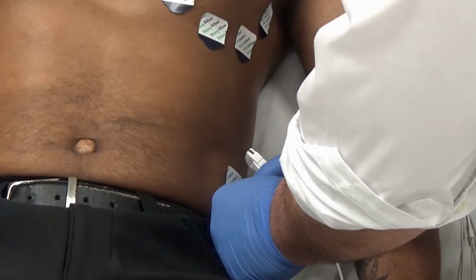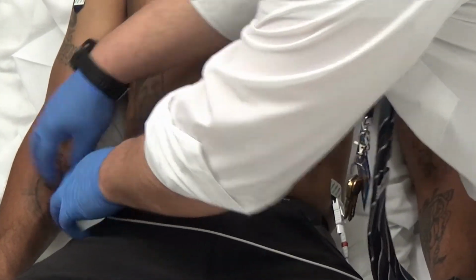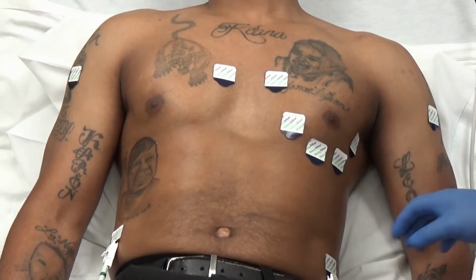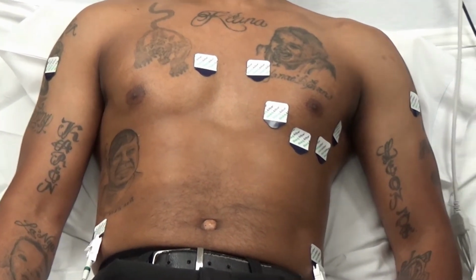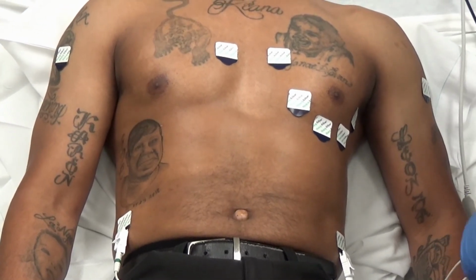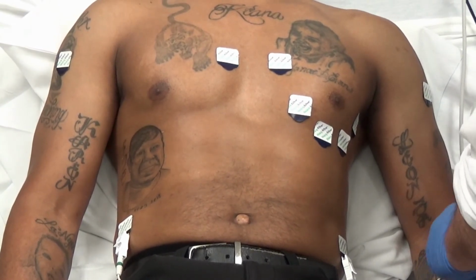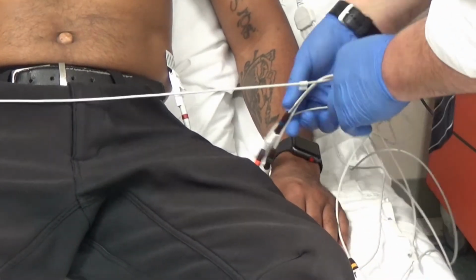So again, left lower, right lower. Yeah, and that's a challenge you'll have sometimes, to untangle these things.